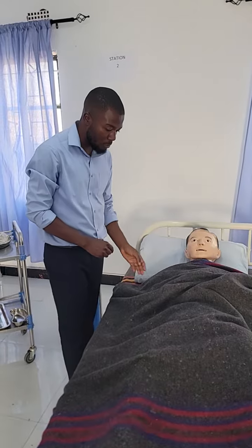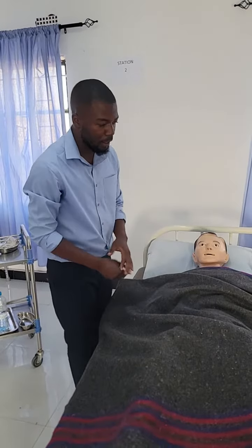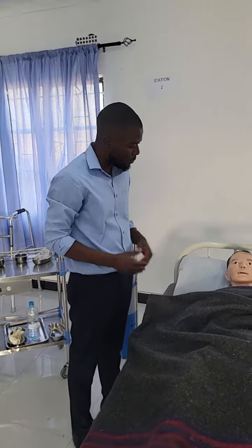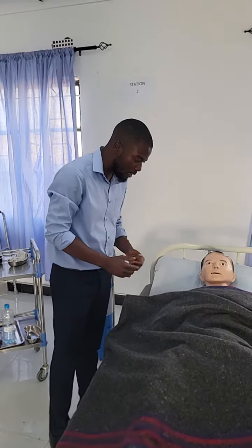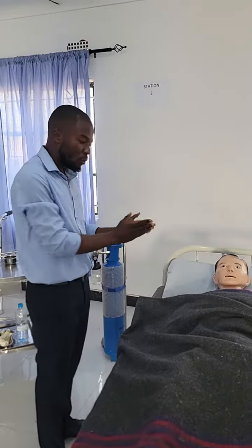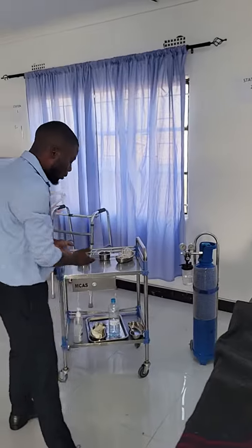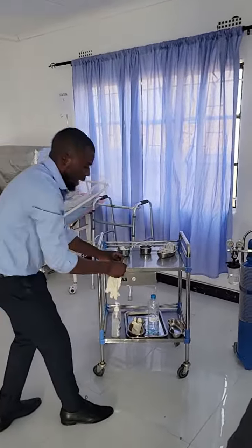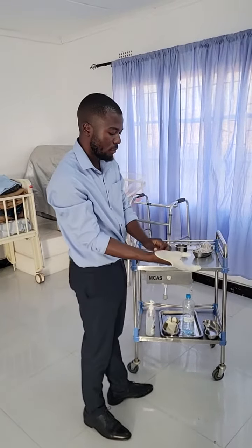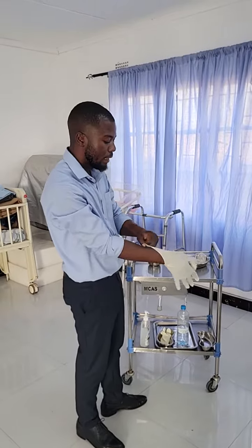How about while you are sleeping, how is it? So you have to assess. Then the other thing you have to do is to ensure privacy. You say, don't worry about privacy, I have already screened. So she has allowed me to do this procedure. The next thing I will do, I will prepare the trolley, and then I need to don gloves. So you don clean gloves.